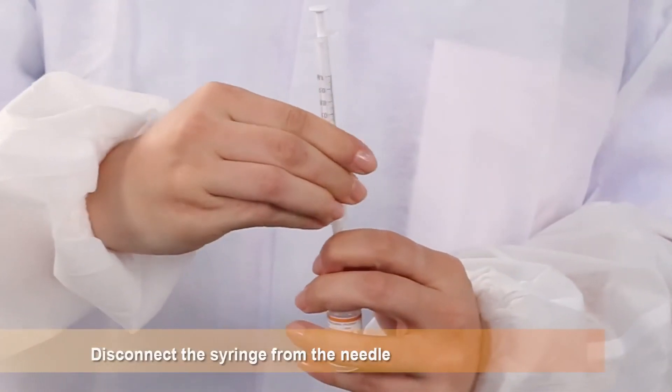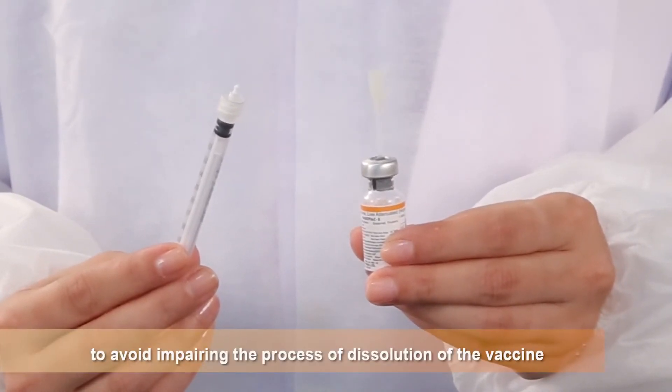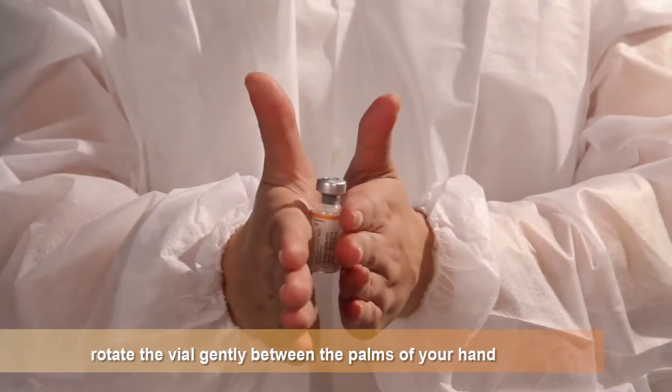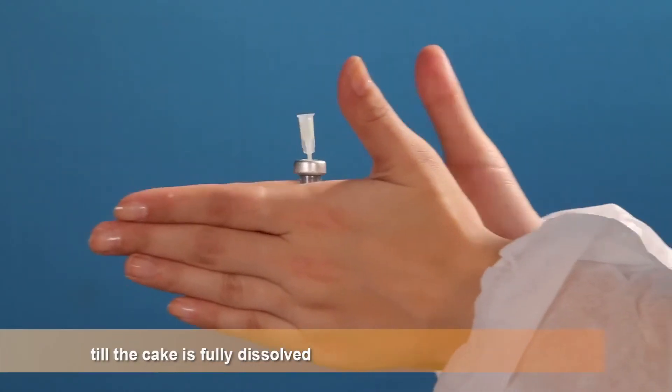Disconnect the syringe from the needle to break any residual vacuum to avoid impairing the process of dissolution of the vaccine. If there is any delay in dissolution of the cake, rotate the vial gently between the palms of your hands till the cake is fully dissolved.